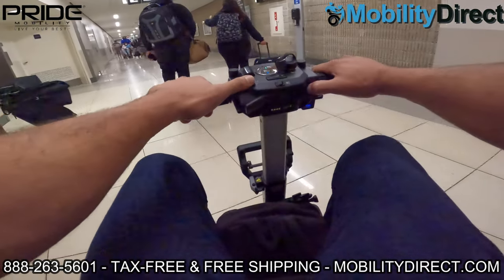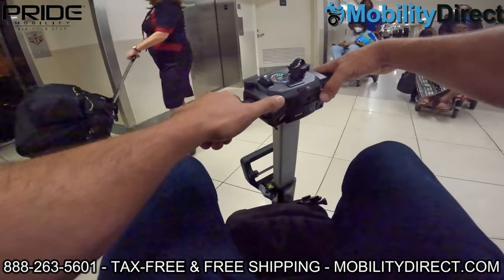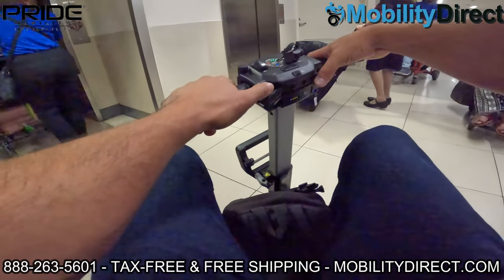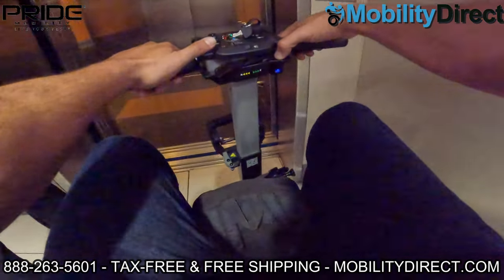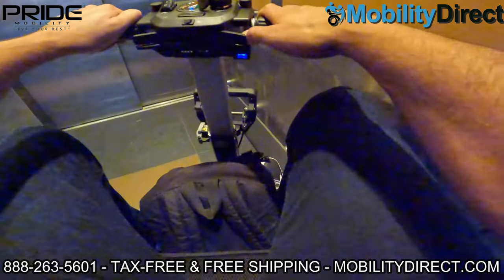I'm just waiting for the elevator here with a couple of other individuals that are being chauffeured around in wheelchairs, which they do offer as a complimentary service if you need it. But having your own powered mobility product has a lot of benefits. In this video we're hoping to share those benefits with you and show you exactly what it's like so you know what to expect if you have a mobility scooter.